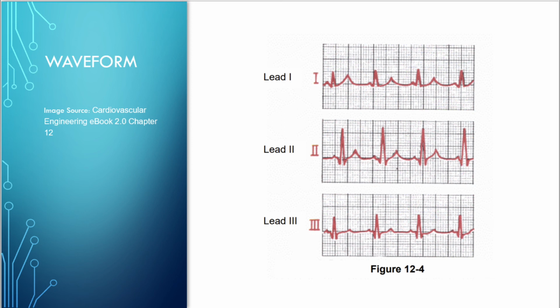When things are not normal, the ECG waveform reflects this. The PR interval can be prolonged, or the QRS wave can be inverted. Both of these are signs that the heart is not pumping properly.